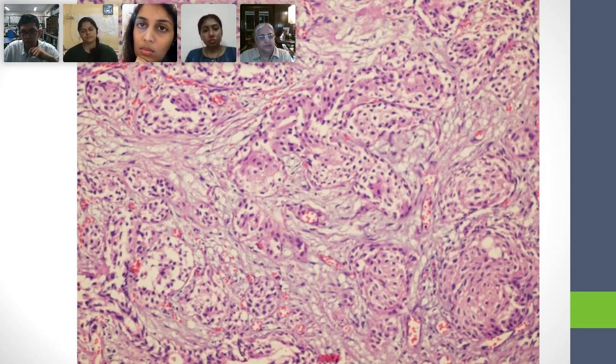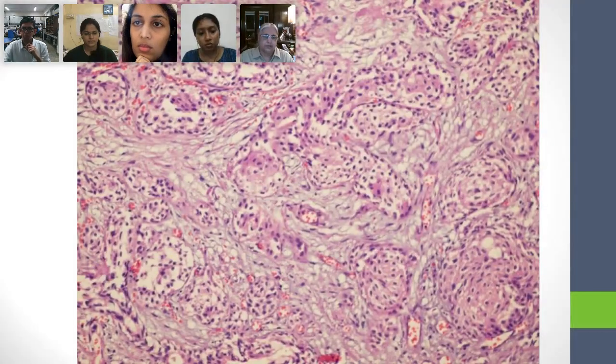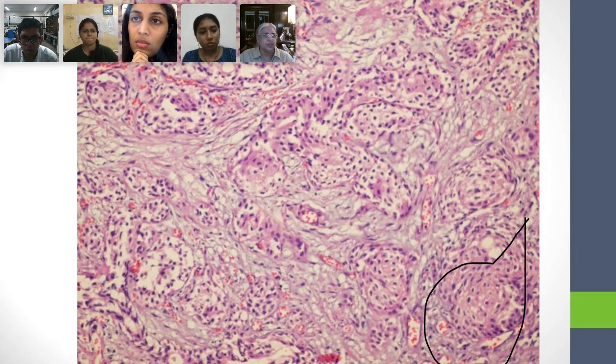Now here, what about this? The cells show similar areas with extensive squamoid differentiation, and there is a myxoid stroma, I think. That's okay. It's a young fibroblastic stroma. But are you going to tell me that all of this is squamous differentiation? I take it that something at the bottom right-hand corner here is squamous differentiation. Yeah. But do you think all of this is squamous differentiation, Ashish?